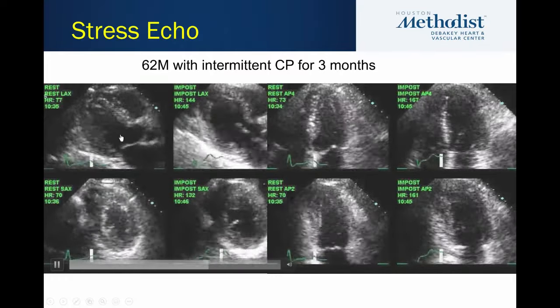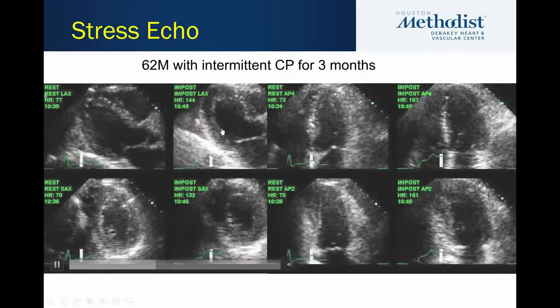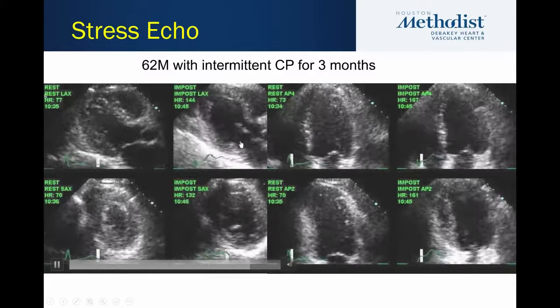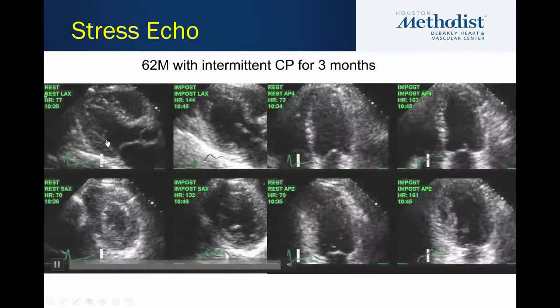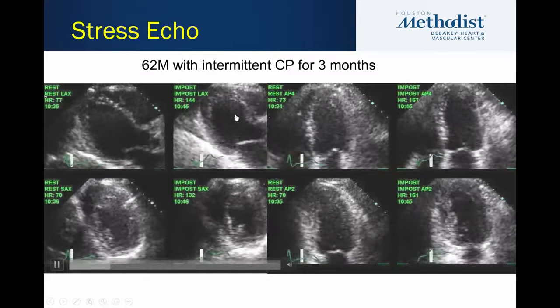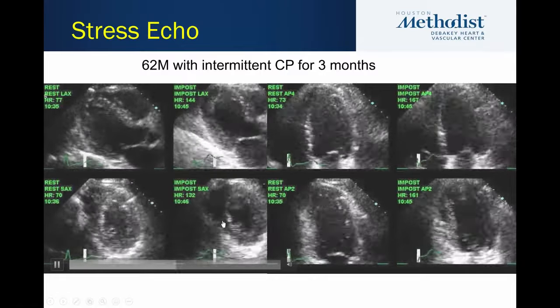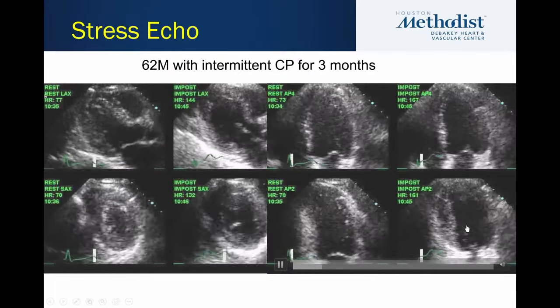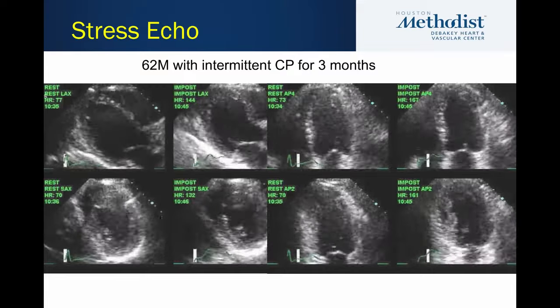Right after the patient comes off the treadmill, notice that the end-systolic cavity is bigger compared to rest — there's been a dilation of the ventricle particularly in systole. Looking at multiple diameters within regions of the heart, those diameters have also gotten bigger. We see this also in the short axis: the short-axis area at end-systole is clearly dilated. This global and regional dilation in end-systole, with a drop in ejection fraction, was seen in a patient with significant multi-vessel coronary artery disease.